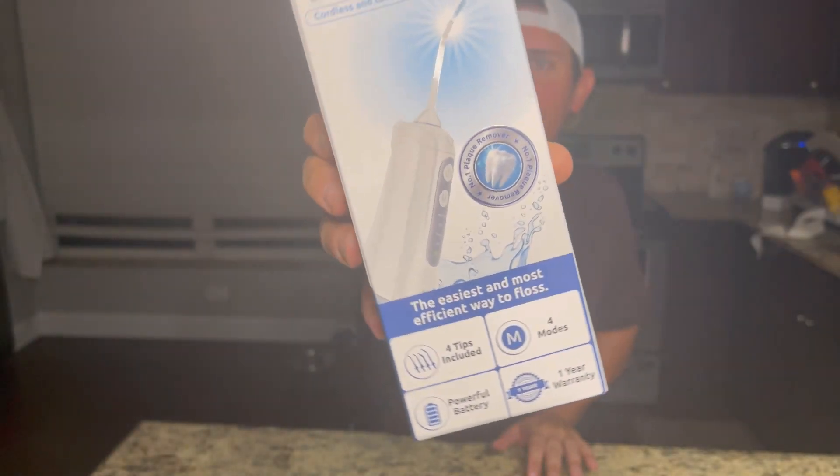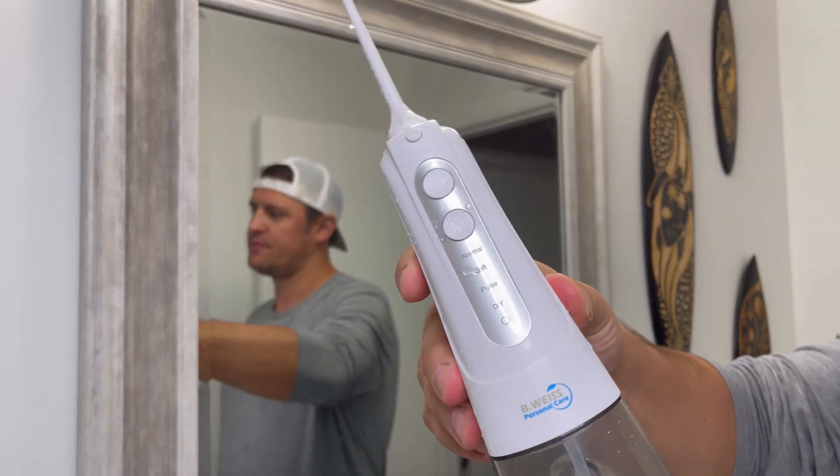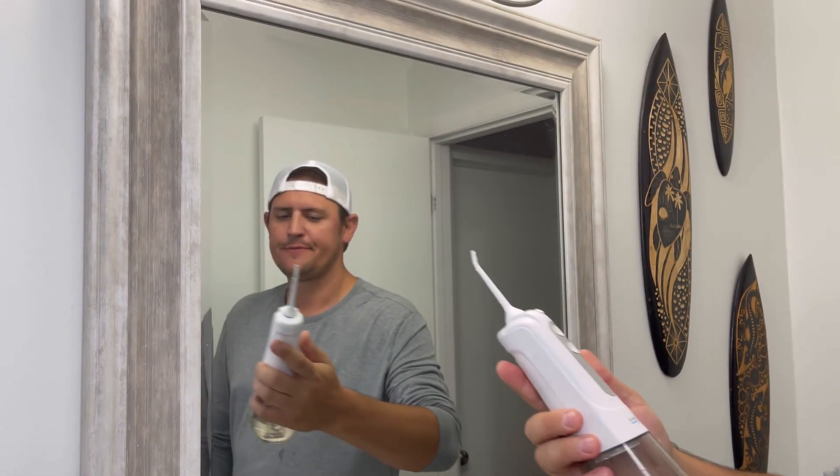The B. Weiss Oral Irrigator — this is the complete oral irrigation kit. I've tried other oral irrigators, but they're either too big and clunky, they don't give me the results that I'm looking for, and I have to charge them once every two or three days. It's ridiculous. But the portable oral irrigator by B. Weiss is an absolute game changer.